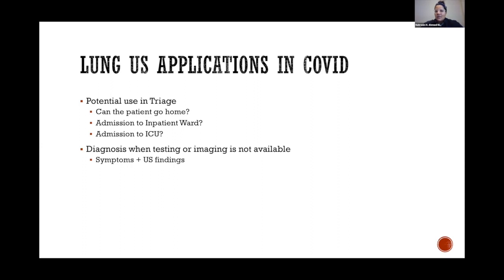One of the biggest things that really limits the lung ultrasound applications in COVID is just infectivity. If you think about taking a device in the room, you have to have the capacity to clean it, because otherwise you are taking that as a vector of transmission to the next patient. And if that next patient is not COVID positive, then you are putting them at risk of an exposure. So really, lung ultrasound is quite limited also by that concept of transmission and vectors of disease.